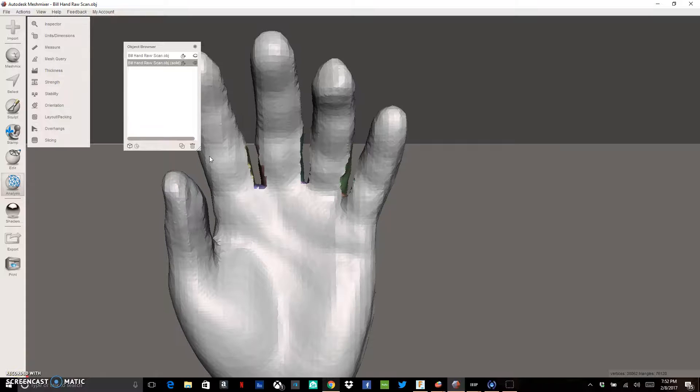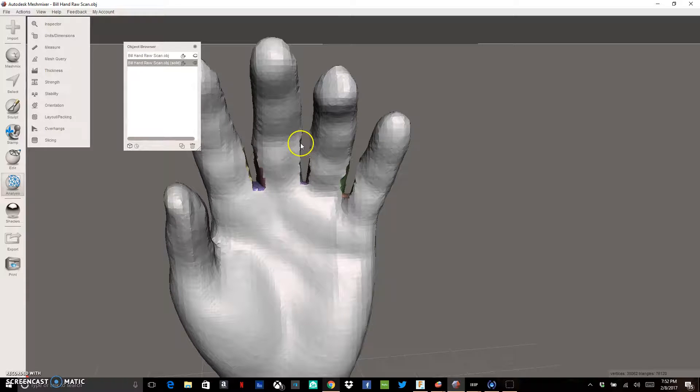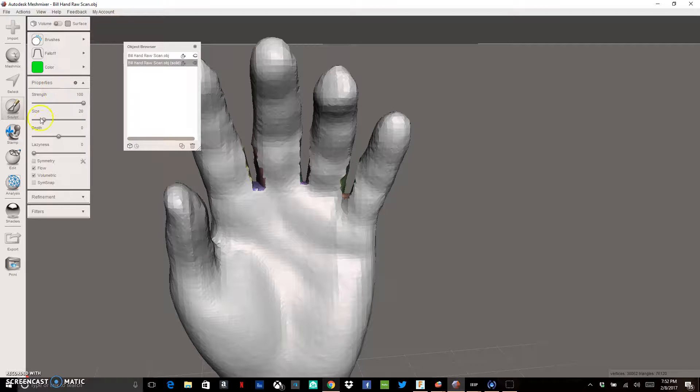Now I've got all the fingers cleared out and the webbing look is gone. Next I need to do some sculpting to make these fingers look more natural — I don't want completely flat areas. I'll go to the Sculpt command in Meshmixer. The most useful brush I've found is the Robust Smooth brush. I'll increase the size a little bit and decrease the strength for this part.